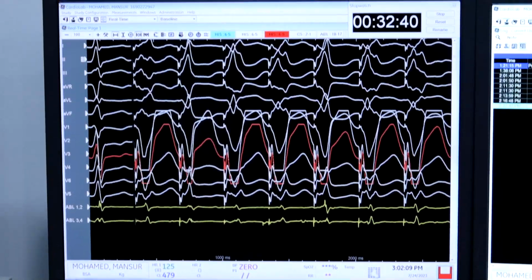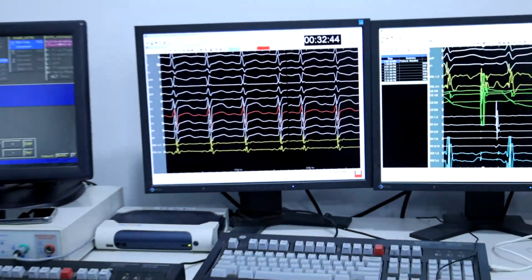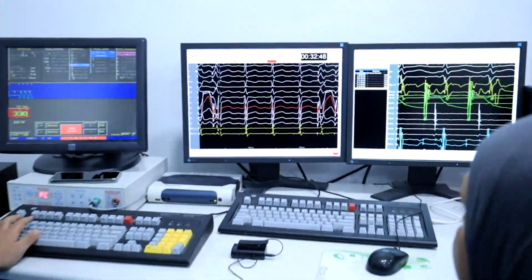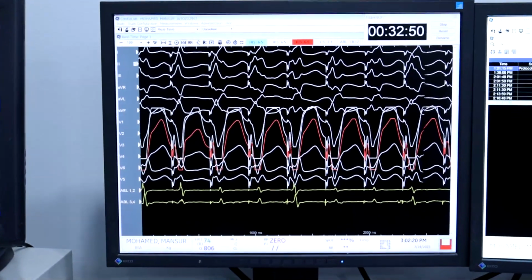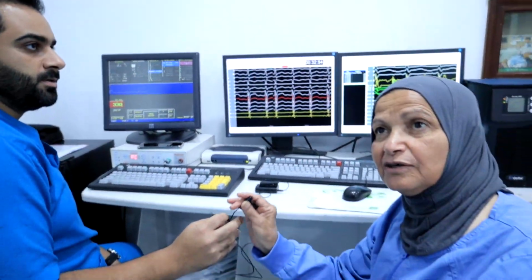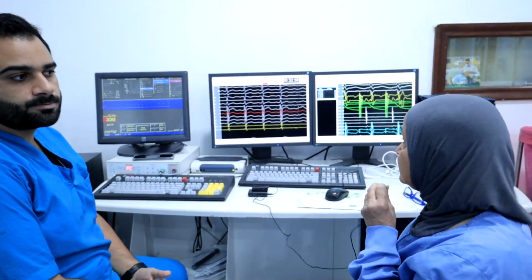Of course, with the catecholamine we increase the sinus rate again. Okay, so to make sure that this is sinus and not tachycardia, I have to look at the ECG at the P wave of limb leads 2, 3, and AVF.